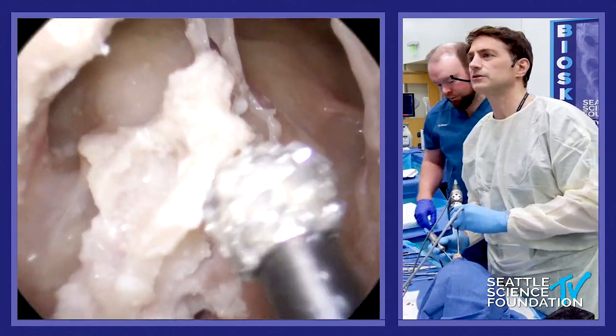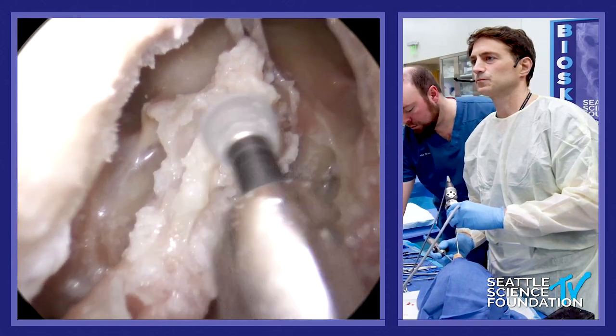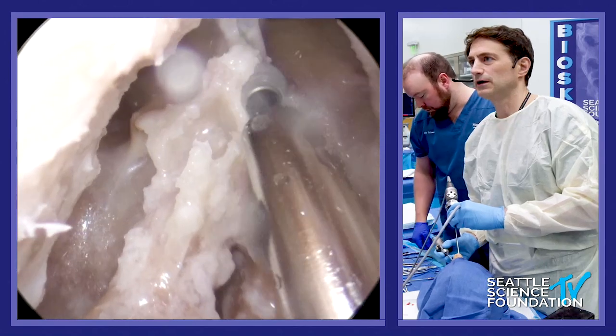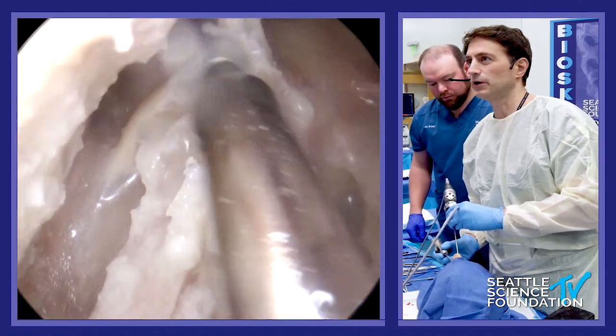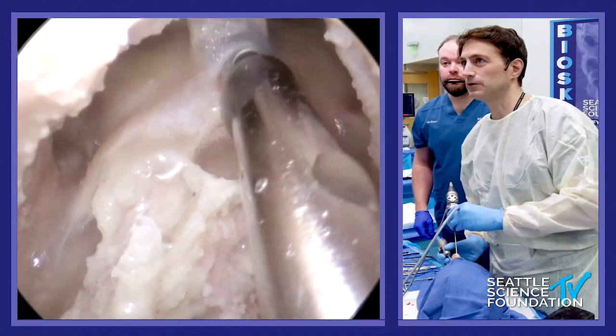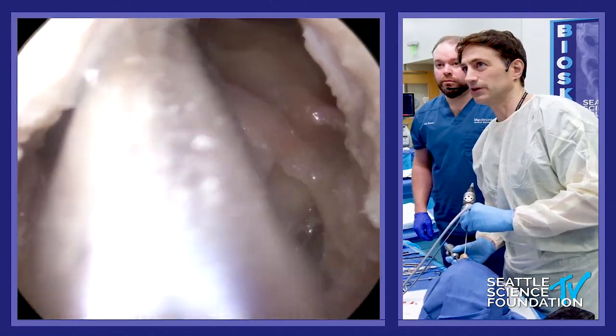Good old bone paste. Now I'm going to take this all the way down to the posterior table, and I like to take this inner sinus septum down.